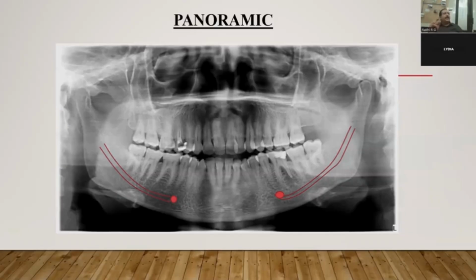And you need to consider a longer implant to derive more support from the still apical area. And now this particular tooth is having a kind of infection. You can consider it as a chronic infection, present there since a long time. So bone loss is expected here. More than that, an infectious source like a periapical granuloma or even an abscess directly could be present in the apical region. Can we go in for an implant placement in a site having acute infection?